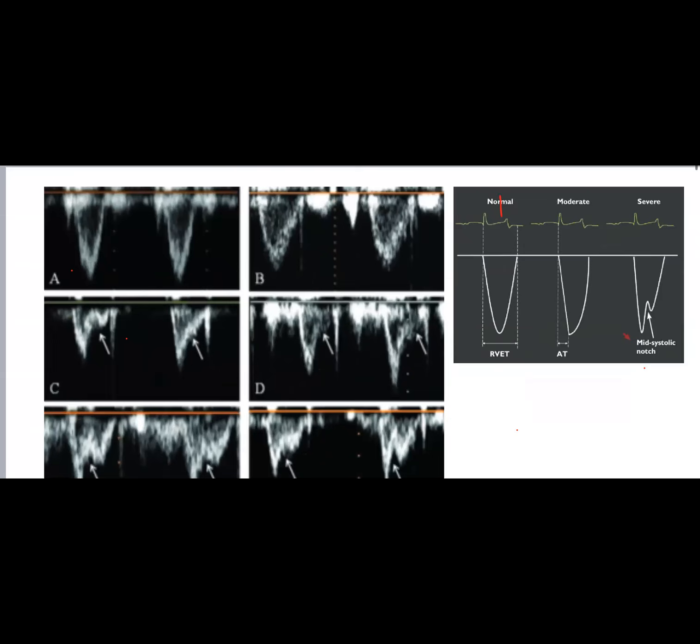Okay. Now, what do we see here? What is this? Diastolic flow reversal. No, to make it easier for you, this is a pulmonary venous Doppler. Pulmonary venous Doppler. Pulmonary arterial Doppler. Yes, this is the pulmonary artery. Yes, it indicates severe pulmonary hypertension. Thank you so much.